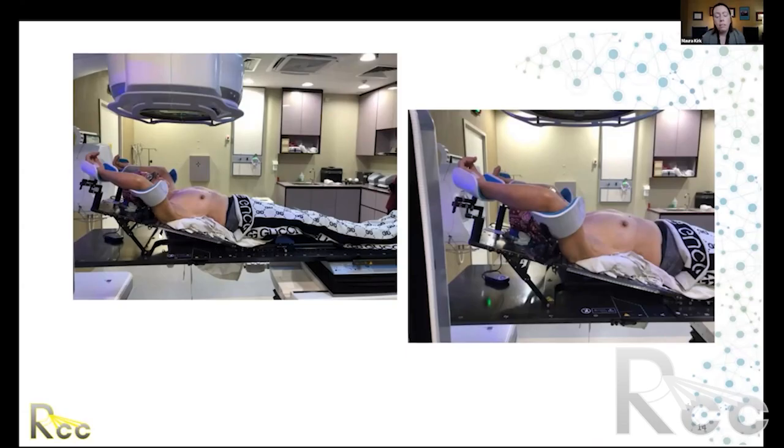If there is a need and the patient really cannot lay on something hard, a better option might just be a uniform pad that you could put under the patient, like a styrofoam thing or some kind of material that you know you're putting the same thickness in every day for the patient to lay on, so it won't affect the angle of the patient's back in this way, which will really change your treatment area.